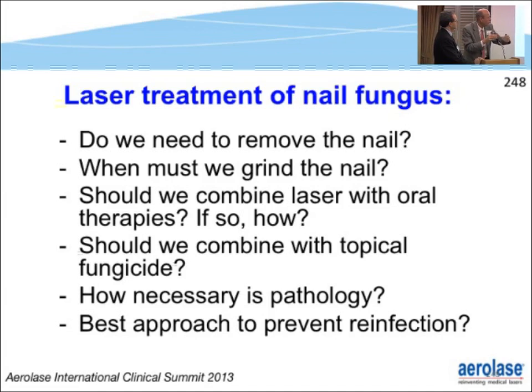And if you want to go high fluence to 10, that would be 25% more. So to use, let's say, the same energy, the same fluence, 1.5 may not add anything. Then you are simply applying too much energy. So maybe you should simply switch to, let's say, a 2 millimeter spot or 3 millimeter spot, right? I don't think that you want to go to 318 joules per centimeter square on a 2 millimeter spot, because 2 millimeter with 0.65 is 255 joules per centimeter square.